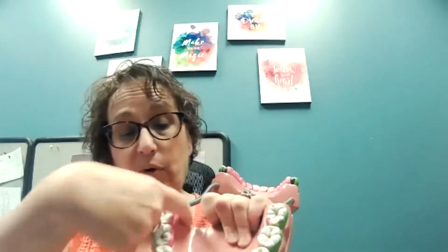So if I have a patient that comes in and tells me, I can't bite down on it, I'll put my finger right in here and say, look, my finger will drop down about this far. I'm like, sure you can. You can close your mouth, you can bite down on this x-ray without a problem. There is a little pocket right there where your finger will go. If you go more towards the middle, you can actually get the film in. You just have to talk to them.